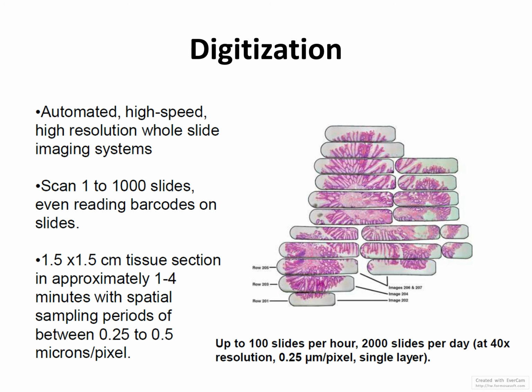For these machines, if you have experience using scanners, you probably know it takes a little bit of time to finish scanning one sheet of paper. But with pathology slides, imagine that you need to use a microscope to scan everything on the slide in very high detail.